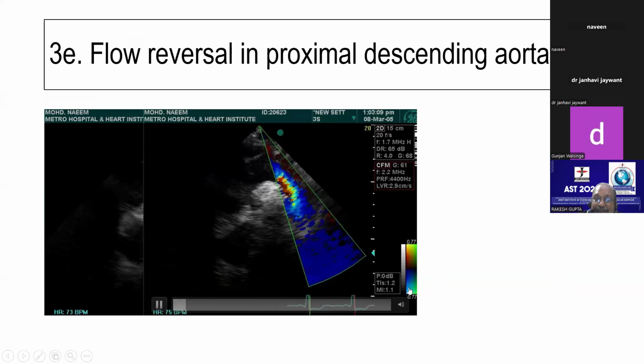Normally you are tuned to red and blue, correct? You remember what is VIBGYOR? Violet, indigo, blue, green, yellow, orange, red. So all the colors are seen over here, and this map is known as a variance map. In your machine, you'll have 3 maps: normal map, enhanced map, and variance map.